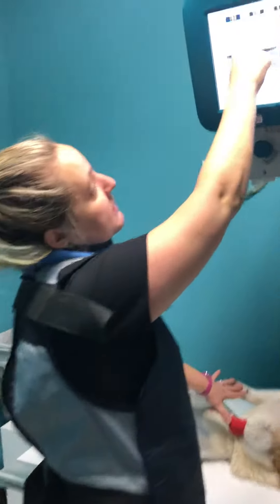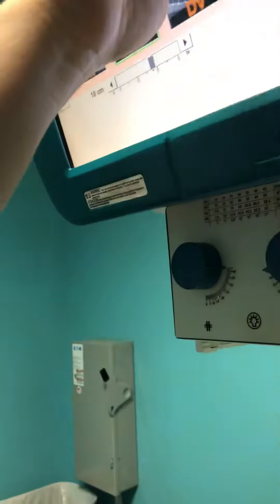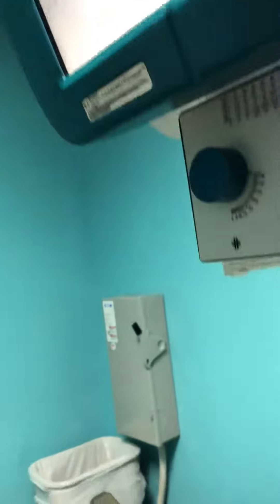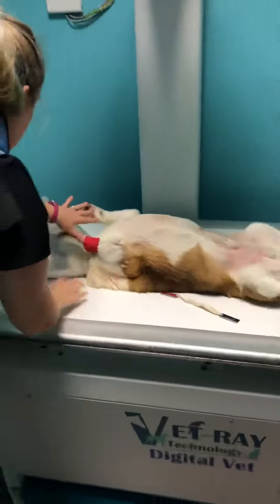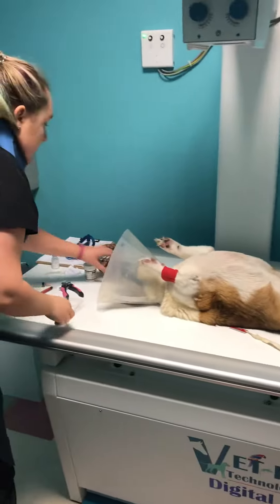Our KVP is 102, MA 250, MAS is 3.2, and our seconds is 0.012. We have our marker set in the frame.